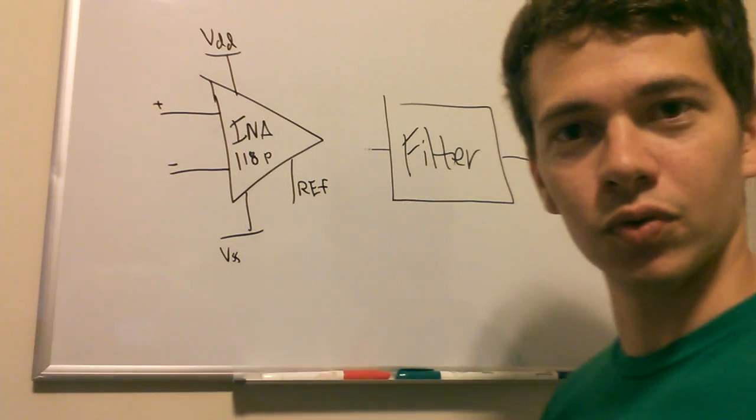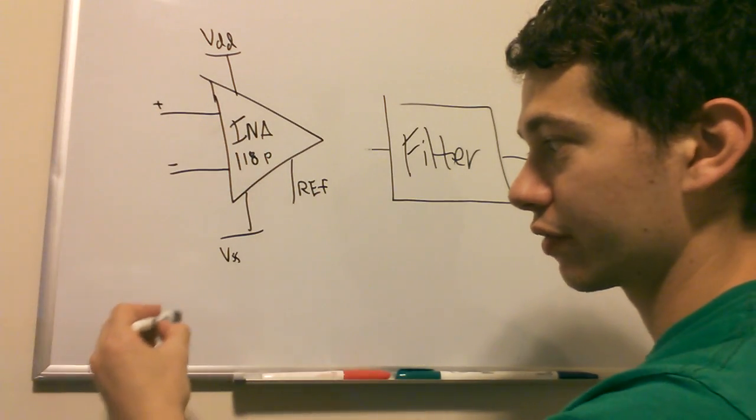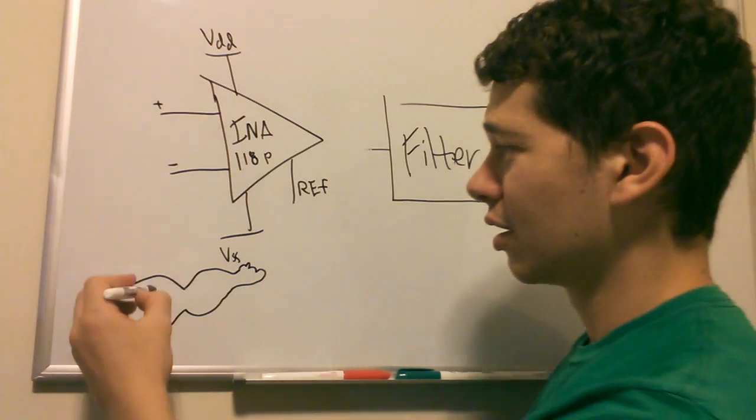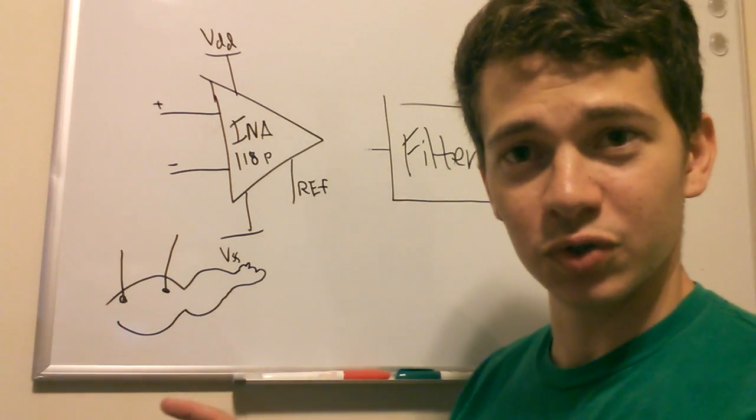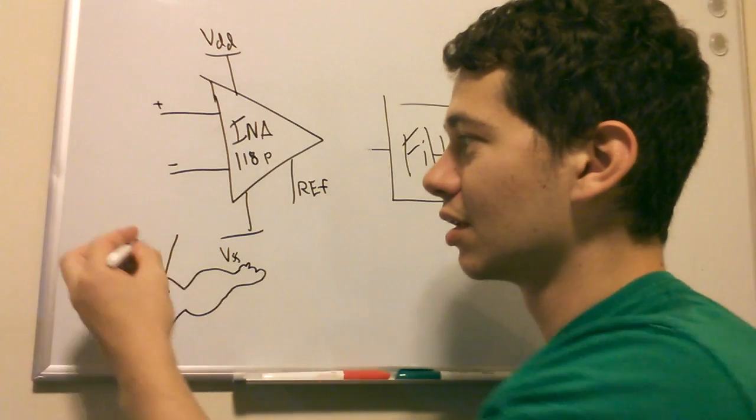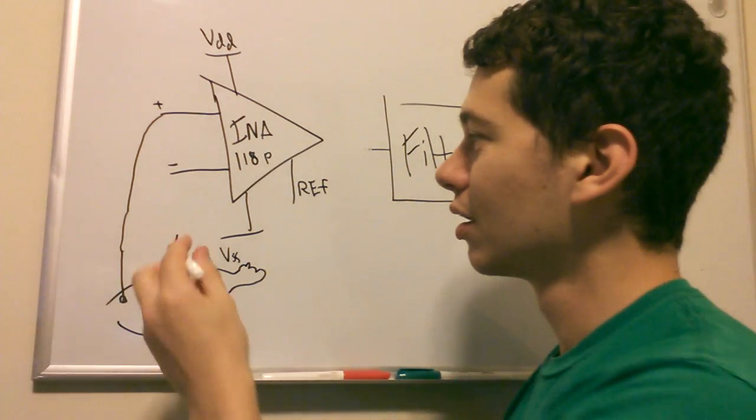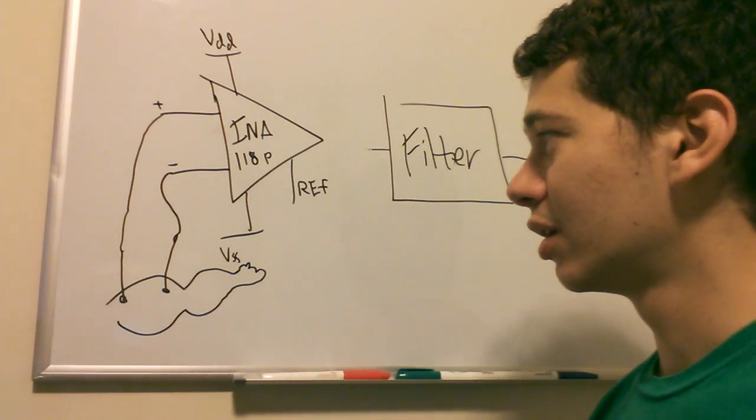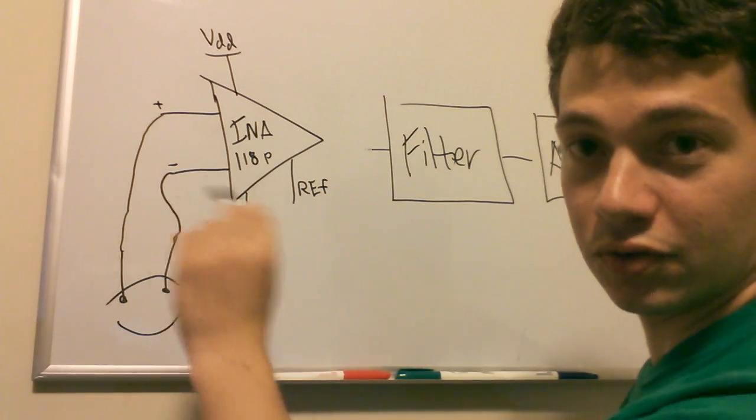So if we're doing EMG, let's say we have someone's arm here. He's pretty jacked. Let's say you have an electrode here and an electrode here. We want to know the difference between the voltage difference between those two electrodes. That's basically what EMG is. And I might have the orientation wrong, like which one's negative, which one's positive. You can just flip it around and see which one works better. So that's our input.